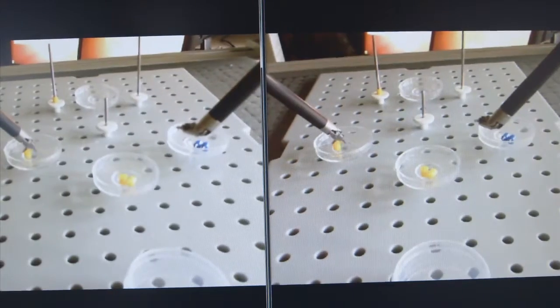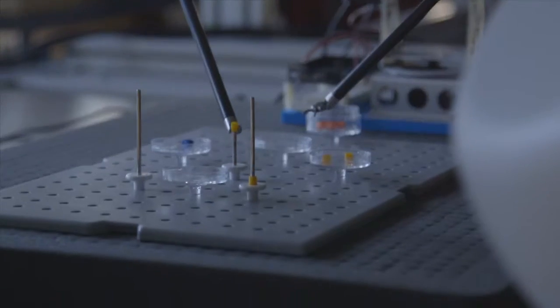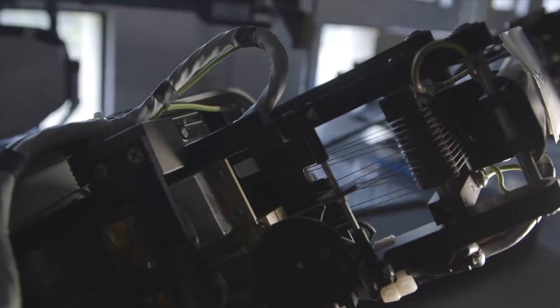A lot of the surgical robotics and medical device industry has spurred a new revolution in innovation and entrepreneurship. There's a lot of interest in now creating end effectors for some of the new surgical robots. End effectors that give you enhanced dexterity within the patient's body. End effectors that will allow you to recapture the sense of touch, so the haptics. So one of the things that happens when you use a minimally invasive instrument is you compromise on your sense of touch. In being able to recreate that sense of touch, you have immense opportunity.